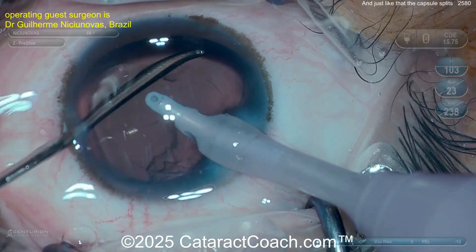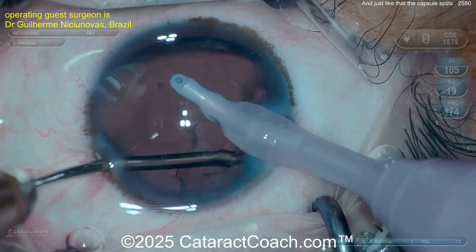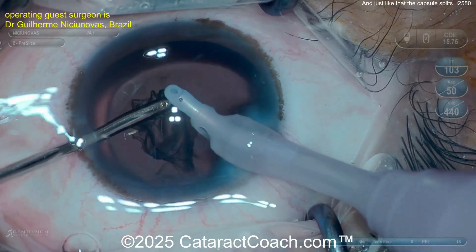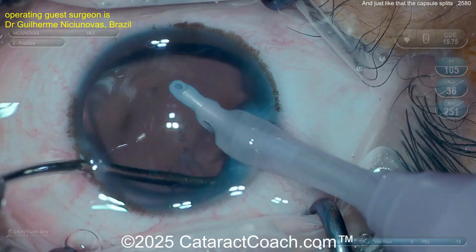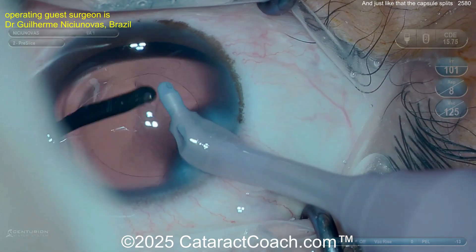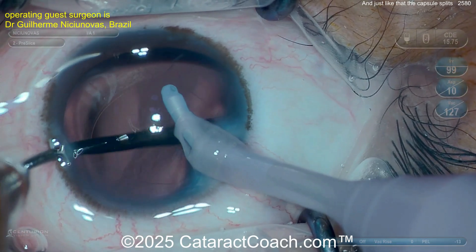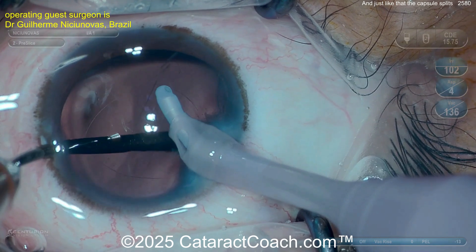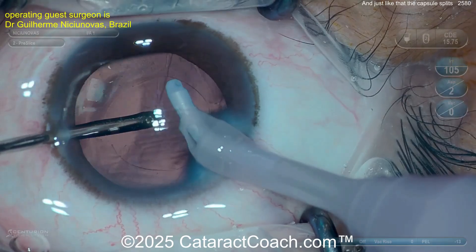By manual cortex removal, watch carefully — cleaning up that cortex, all pretty routine. Now, assuming the instruments are fine, no metal burr on the aspirator, you go inside and polish up the capsule a little bit. Then — look, look, look — right here, polishing the capsule, and pow, it's open.